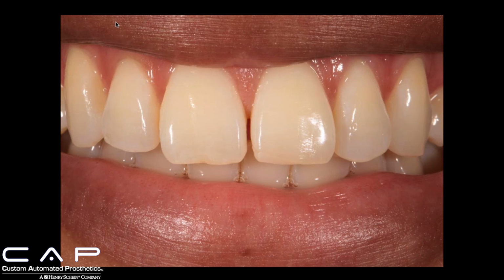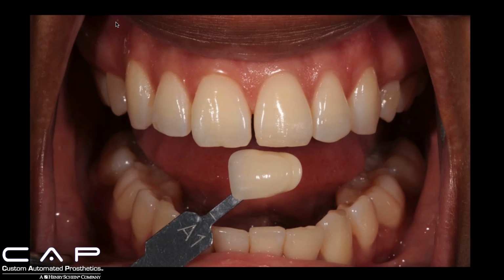Oftentimes the patient will drive a long ways, or it's inconvenient for them to come to your lab, so it's very important to get everything that you need on the first visit, because in reality, they can't always just come back. It'd be nice if we could see them every day, and do a try-in of our restoration every day and see everything. And sometimes it's more possible, but oftentimes we're all busy, we all have to work. So it's important to capture everything that you need in that first visit.